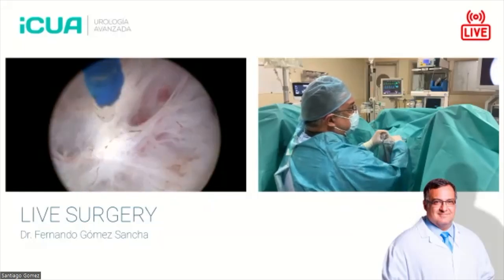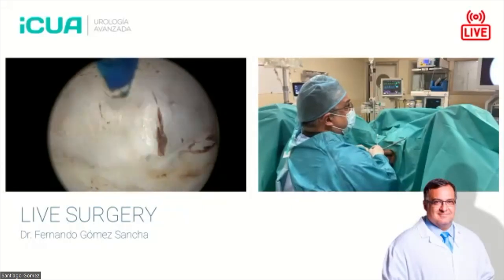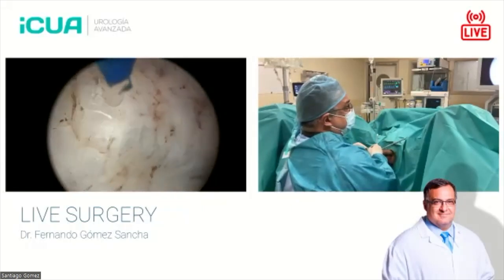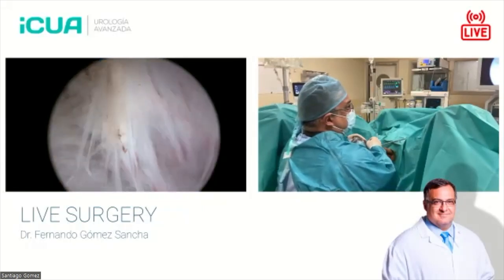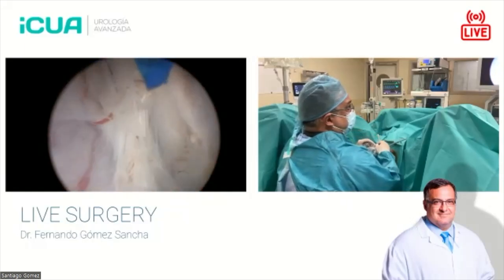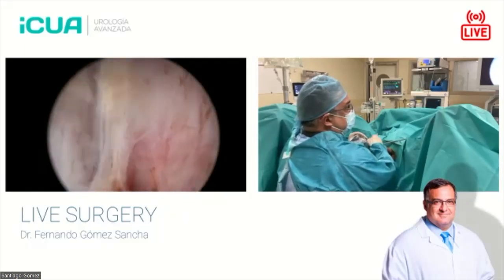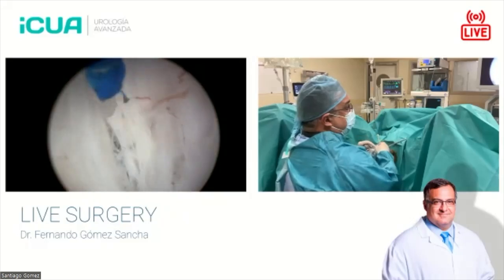And I struggle a lot with low power, and I don't think there is a clear advantage, or let's say demonstrated advantage, to low power. I don't believe that patients do better than with high power. And I will give you an argument.